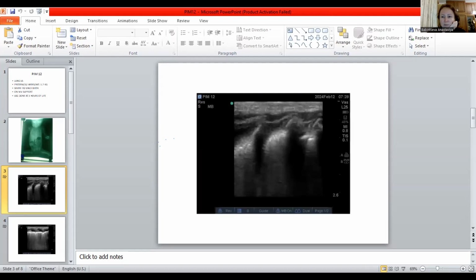And really, what you're trying to do, if you have atelectatic lung that you're recruiting, is keep your probe there, keep watching, and go up by increments of PEEP of 2 or PIP by 2. What I do is wait about 3 to 5 minutes to see if I can actually see the pleural line getting established. And if I can see the pleural line getting established and my baby's getting better, I would wait. Some people basically want the entire lung open.